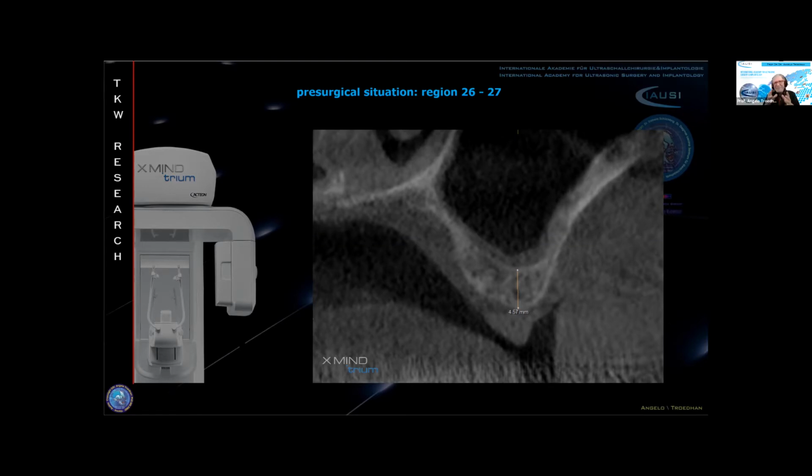Because from the standpoint of the bone, it is bull. Why? Because the bone is not made to sustain chewing forces distributed over such a small surface. Why do the companies try to sell you short implants? Simply because they want to sell, and they don't take care about the fate of the patient and your legal fate in case something happens. They just want to sell, and they pretend that you can also have integrated implants of 4.5 mm.